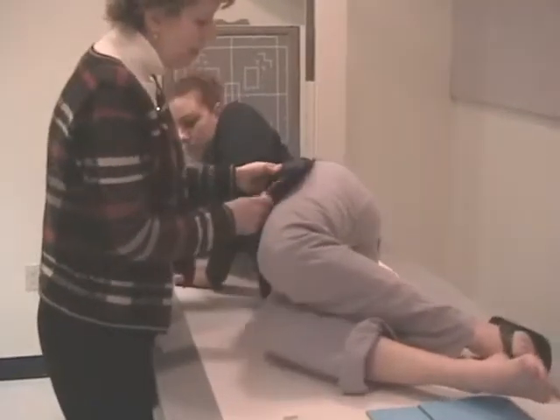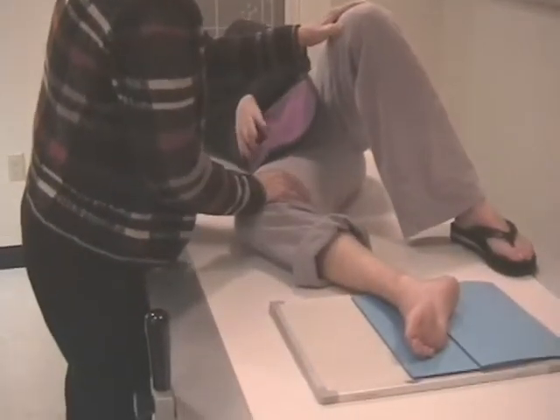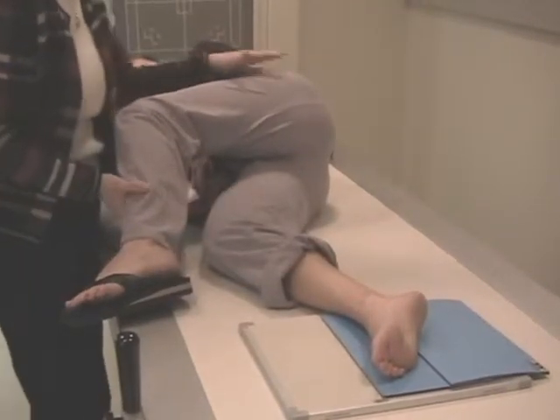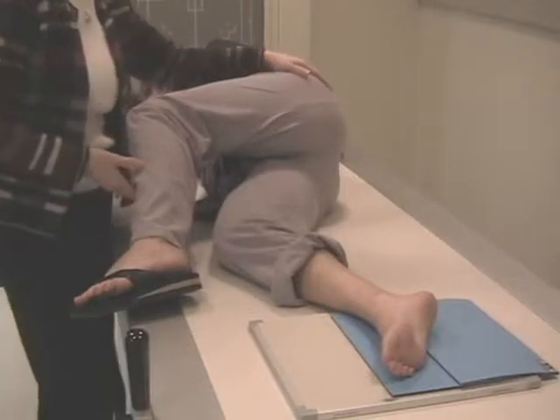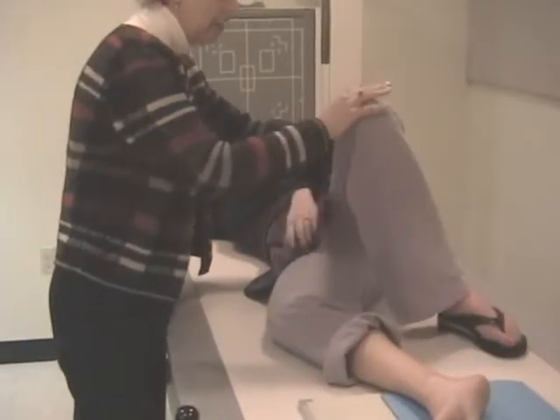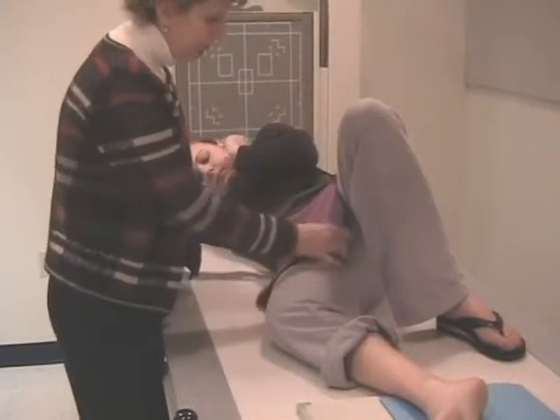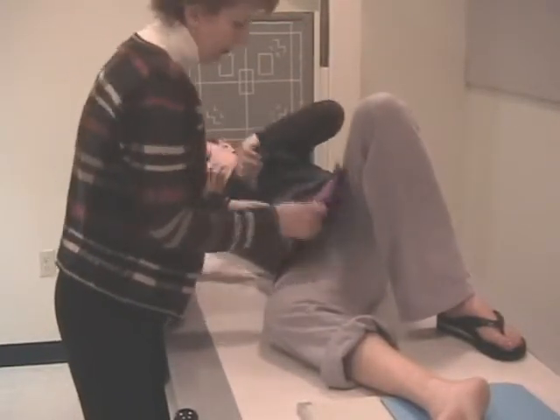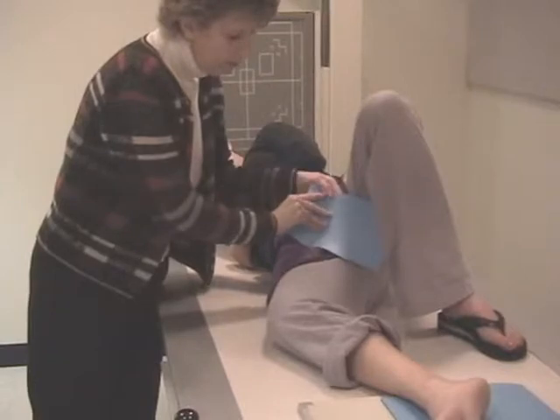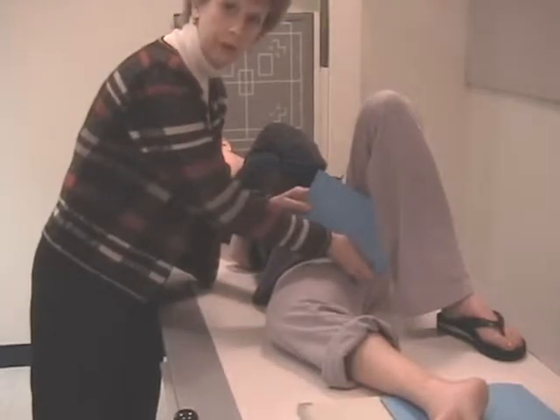I'm going to have to readjust this lead strip a little bit. And sometimes it's best to have this leg back, out of the way, and sometimes it's best to have it come up and over like that. So, watch your patient's body language. I'm going to actually ask Jacqueline today how she's more comfortable with it like that, and then she's fairly stable. You'd have to adjust the lead shield to make sure the X-ray photons are protecting the reproductive organs, and you may even use a lead shield or a glove a little bit deeper in here. But our ovaries are fine, but this would be an option for you to use too if you needed to.